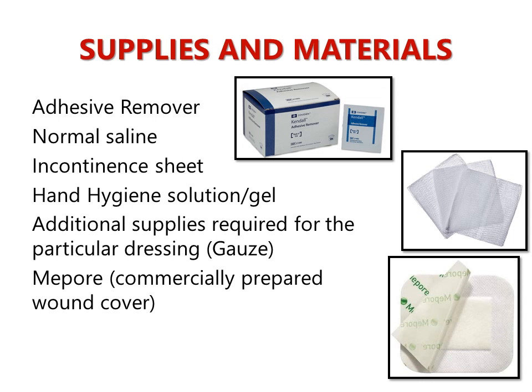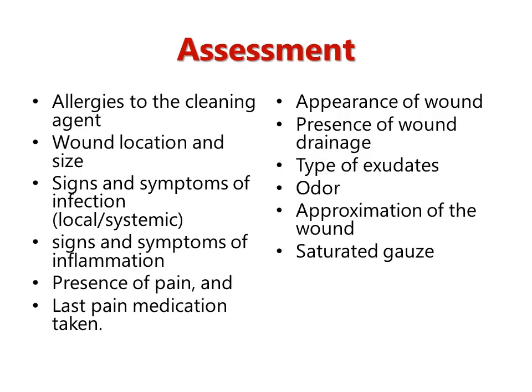You also need additional supplies such as gauze or dressing. And most importantly, after you clean or dress the wound, you need to cover the wound so microorganisms will not get into the wound. Normally we prepare a commercially prepared wound cover called Mepore. Now, you've already checked the doctor's order, you've already checked the nurse's documentation, the materials are ready, and at this point, you are now ready to assess your patient.